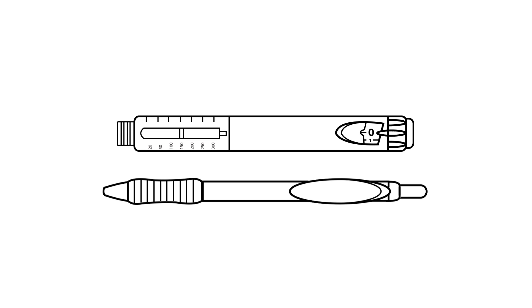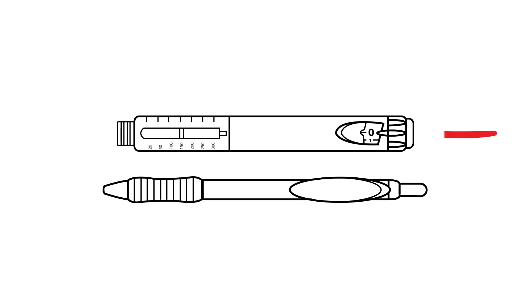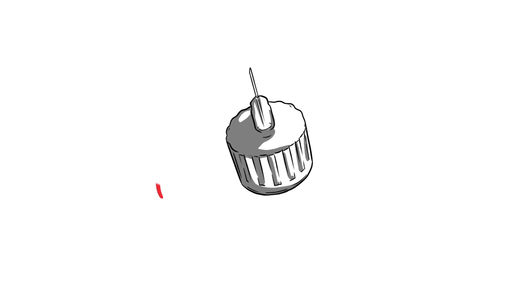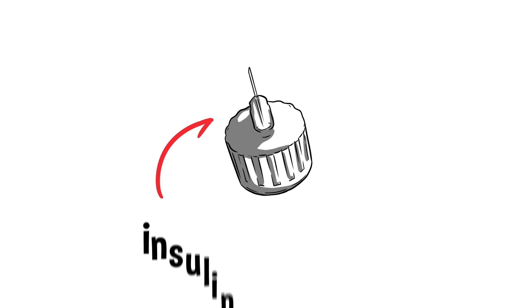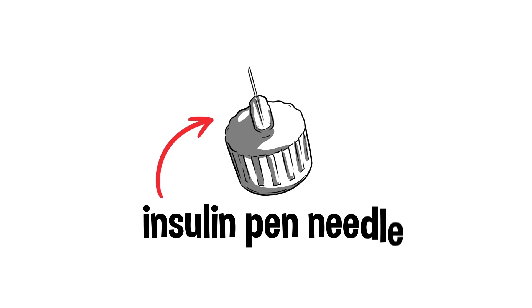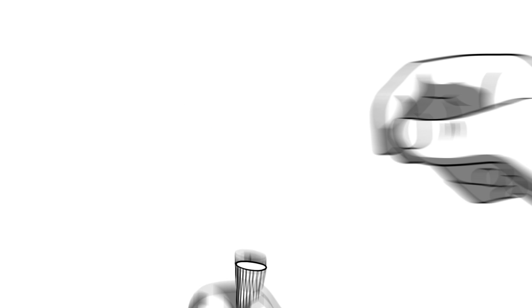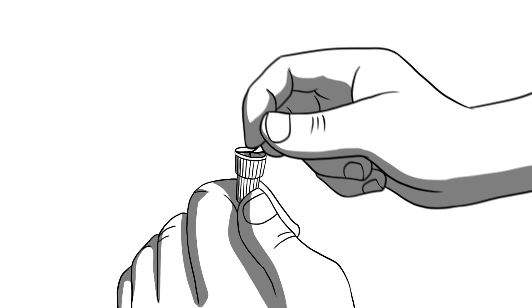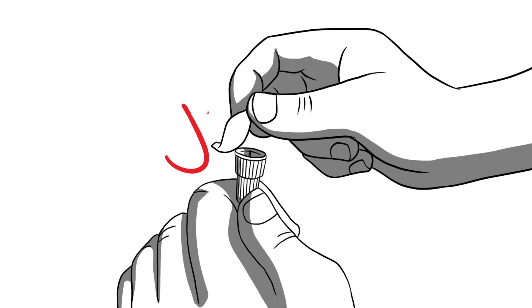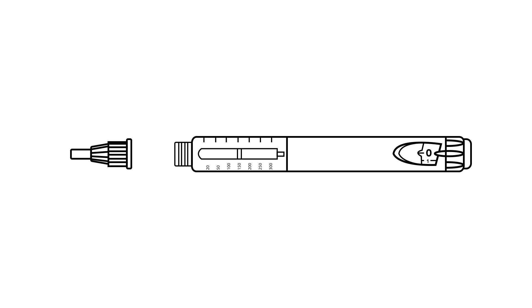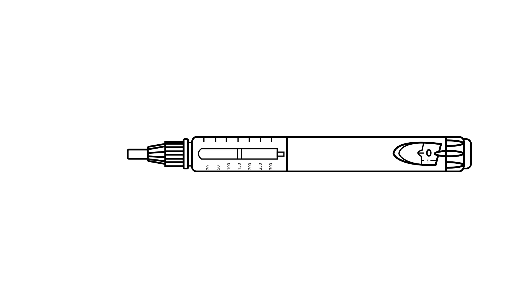Unlike a real pen, clicking the button on the end does not expose the tip. That would be too easy. You have to attach what is called an insulin pen needle. Remove the paper sticker label from your pen needle. The pen needle tip is then attached by screwing it on clockwise, or to the right, for three or four full turns.